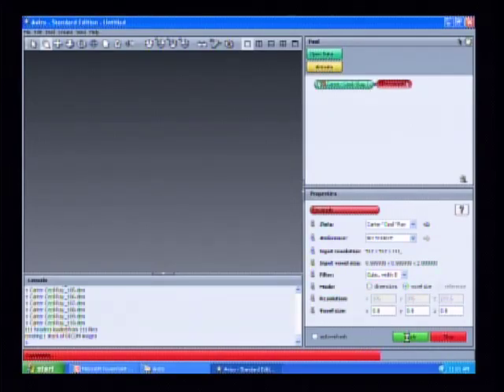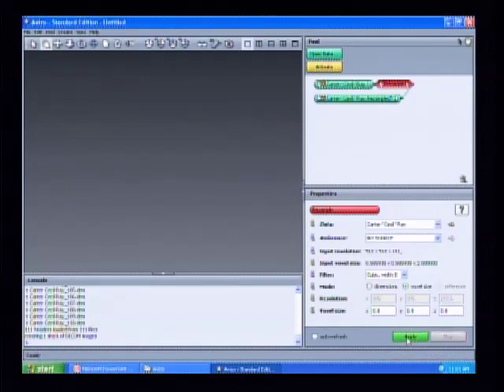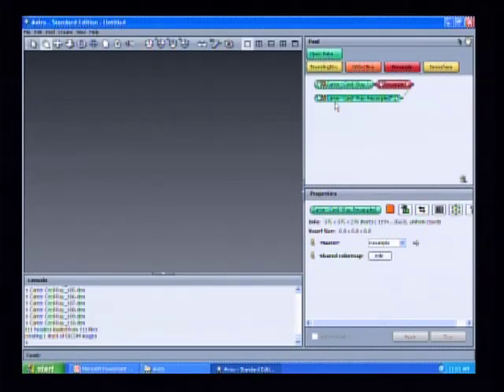In your instructions, it says that a new file is going to appear in the pool, and it has this .resampled file name. So if this has popped up, you now want to make sure that you click on that one so that your properties area changes once again. And we know that we're working on the resampled file rather than the original.